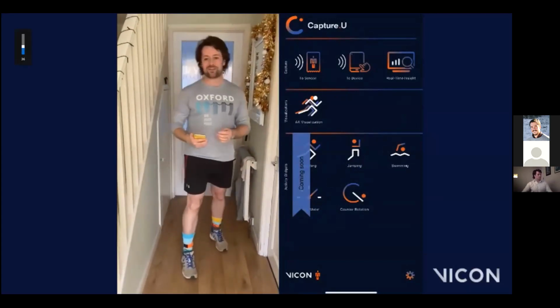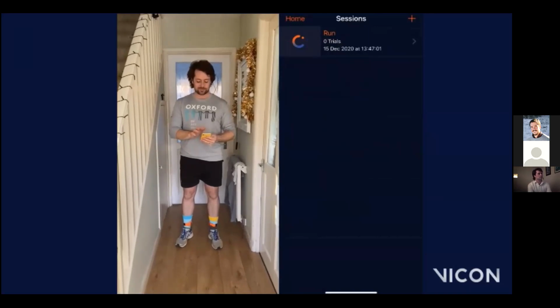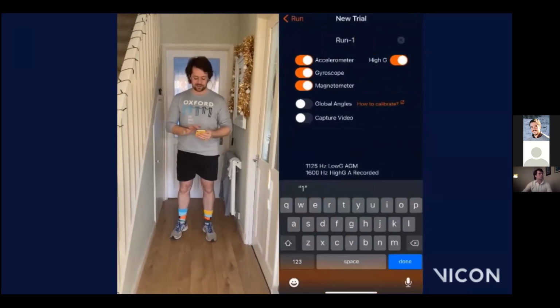I'm ready to go for a run. So to start the session, I'll go to my IMeasureU app, click Capture Sensor, and within the new session, I can select New Trial. I'm only really interested in high G data, so I'm just going to disable these.